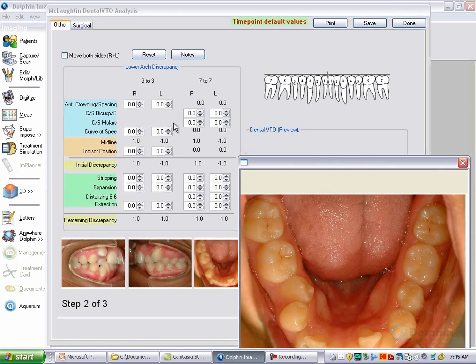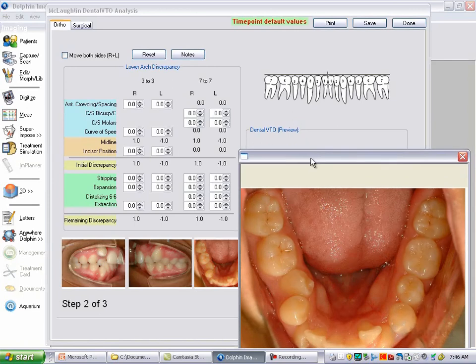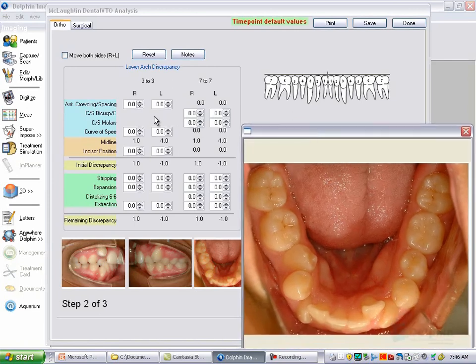And the molar area is dedicated primarily to first molars, but more specifically the second molars. Second molars can frequently be adequately spaced, or they can be crowded. So let's go ahead and move into that area for the arch spacing or crowding. This patient has quite a crowded anterior segment, and he has approximately 5 millimeters on each side from midline to the mesial of the bicuspid on each side. He's got 5 millimeters of crowding.